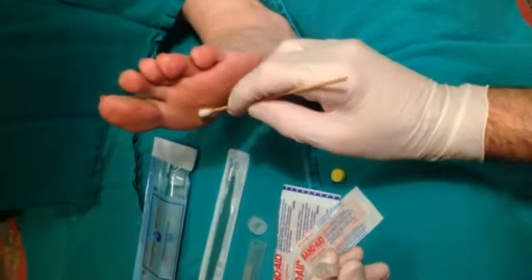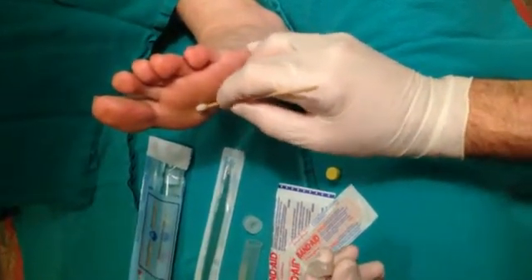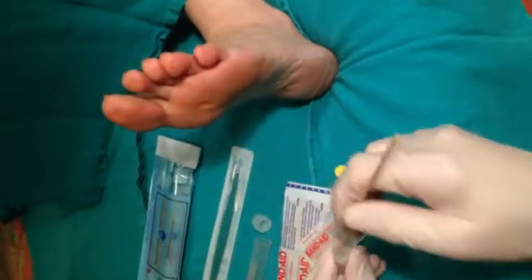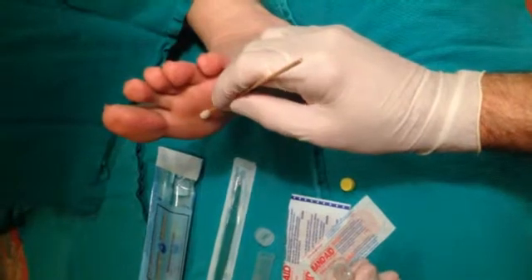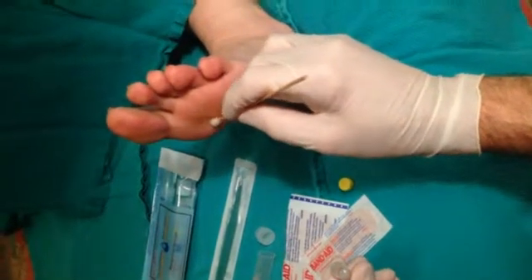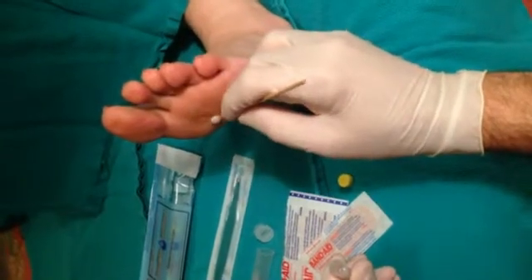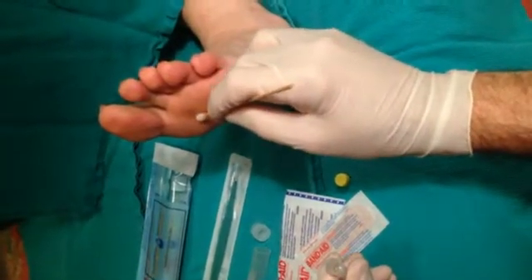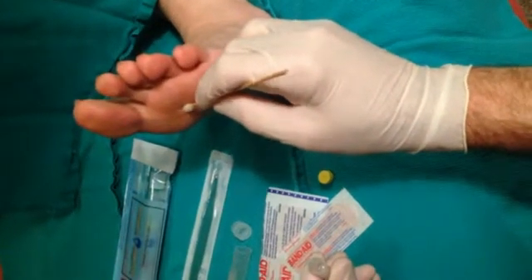Again, you can see how the tissue is being depressed as I introduce these solutions through the lesion — we're wetting again. If you do have multiple lesions, you can use the green solution on several lesions and then follow with the yellow, just like we're doing here.